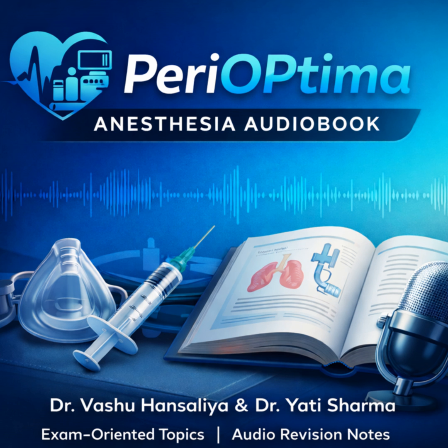But beyond placement, look at the waveform. It tells the story. What if you see a shark fin appearance? That's bronchospasm, asthma, or COPD. The expiratory upstroke is prolonged and curved because of airway obstruction preventing the fast exit of gas. Exactly. And if you see a sudden, precipitous drop in end-tidal CO2 to near zero, but the tube is still connected: cardiac arrest. No cardiac output means no CO2 is being delivered to the lungs to be exhaled.